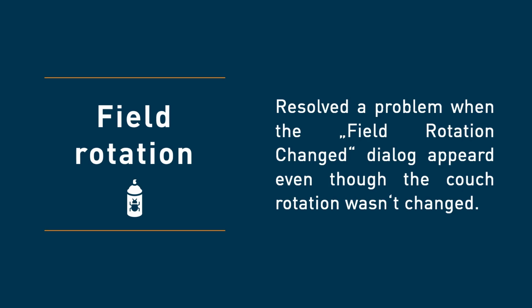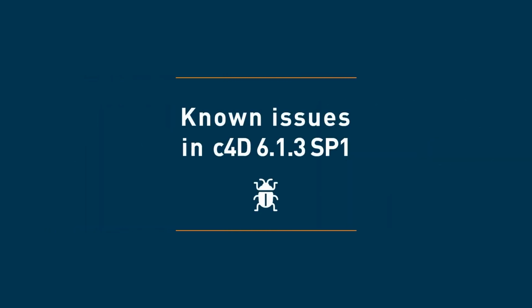And this brings me to our still known issues in 613 Service Pack 1. To not make this video unnecessarily long, I will skip most of the known issues that we have already handled in the previous upgrade training video. But some are new or newly discovered, and some of them I just want to repeat since they are quite relevant for the majority. So please have a look into the release notes for further information.